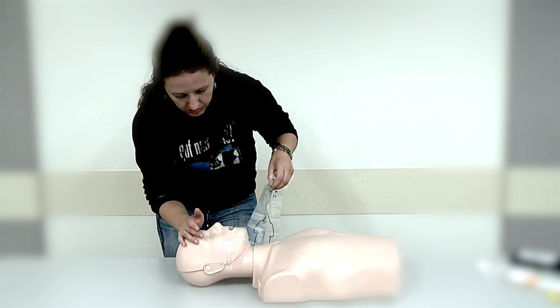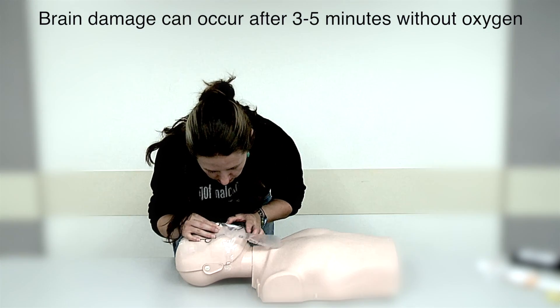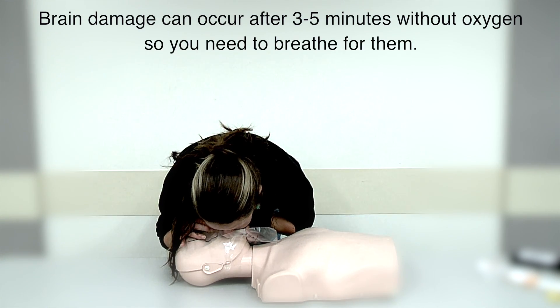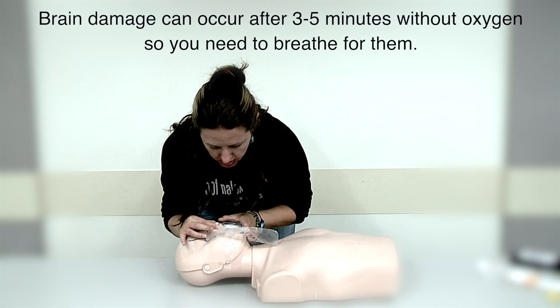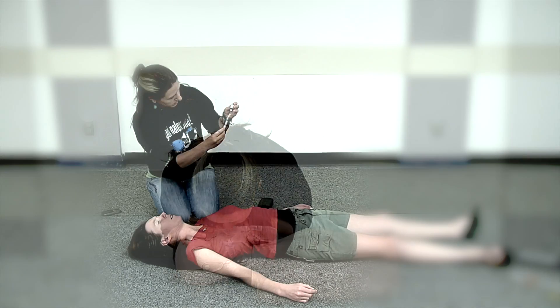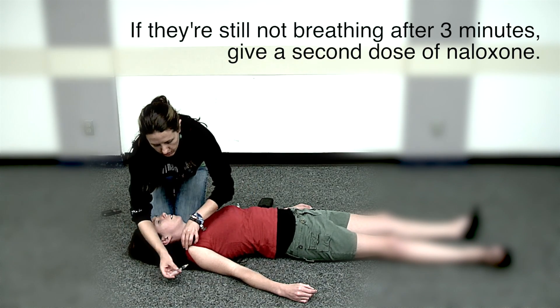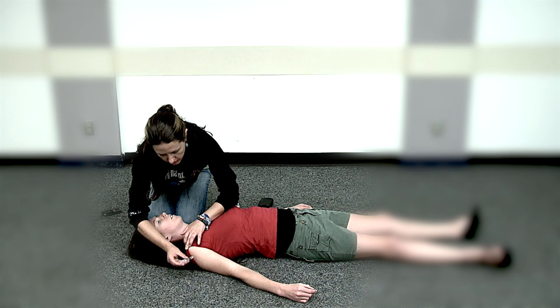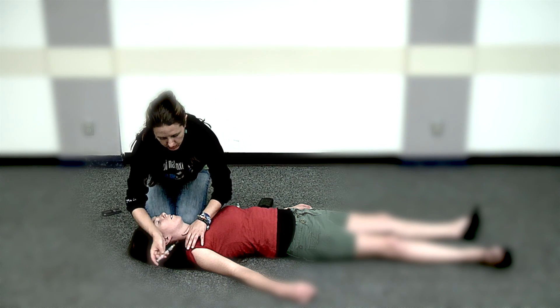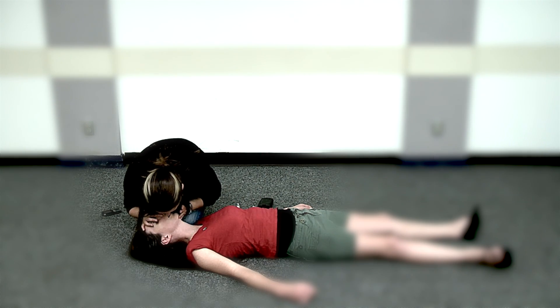Step 5: Give more rescue breathing. It may take several minutes for the naloxone to kick in. Brain damage can occur after 3 to 5 minutes without oxygen, so you need to breathe for the person until the naloxone kicks in. Give one breath every 5 seconds. If the person has not woken up after 3 minutes, give them a second full 1-milliliter dose of naloxone. Continue giving one breath every 5 seconds until they wake up or until emergency medical services arrive.